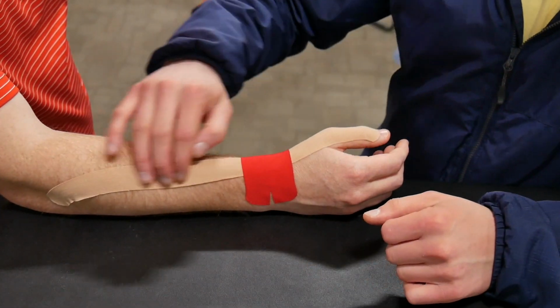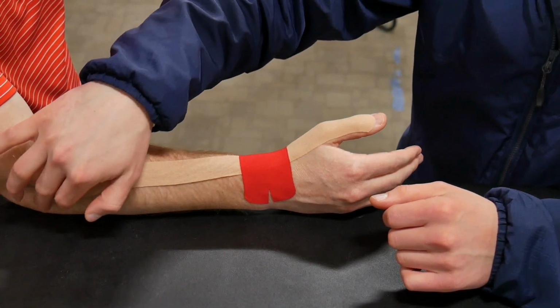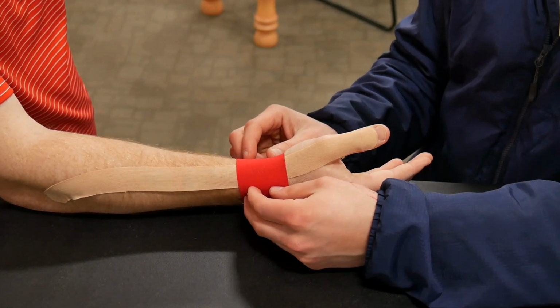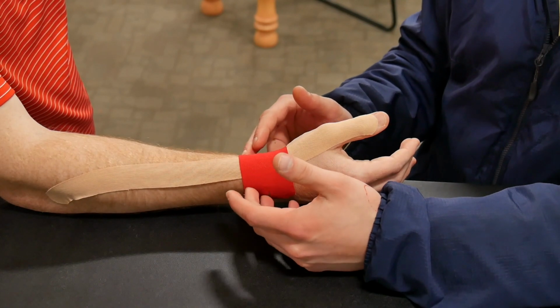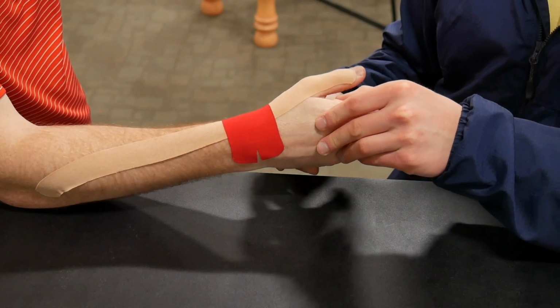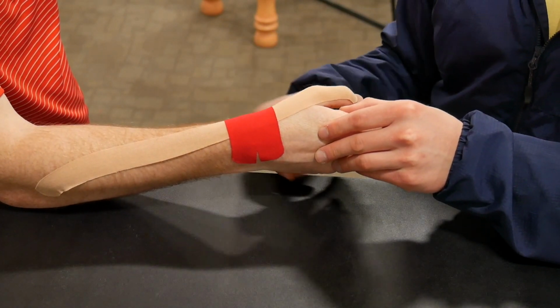Alright, and there you have it, piece of tape number one, running from the base of the nail all the way back to the lateral aspect of the elbow. Piece of tape number two running around the radial aspect of the wrist. And a couple things this does. Number one, as I mentioned earlier, it just creates a little lift to the radial side of the wrist, and it also, this long piece of tape prevents the patient from going into too much ulnar deviation, because of course ulnar deviation tends to elicit more of that pain on the radial aspect.